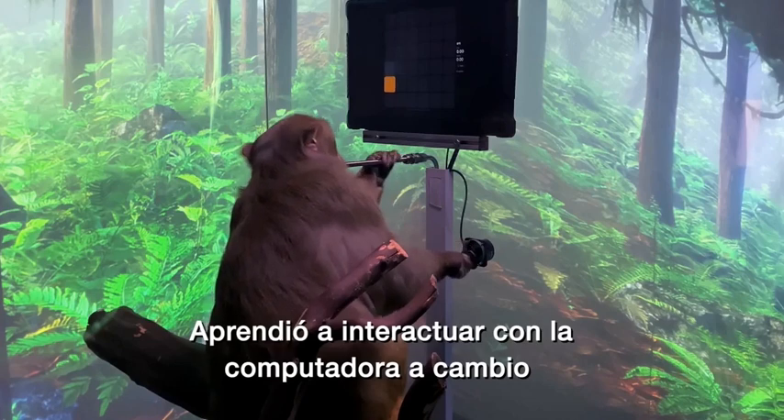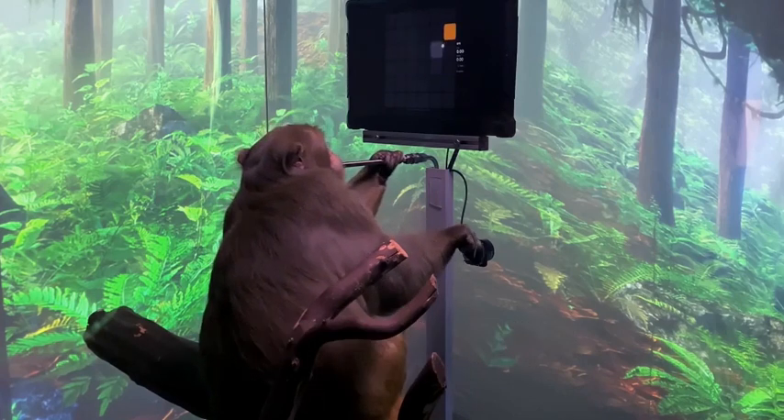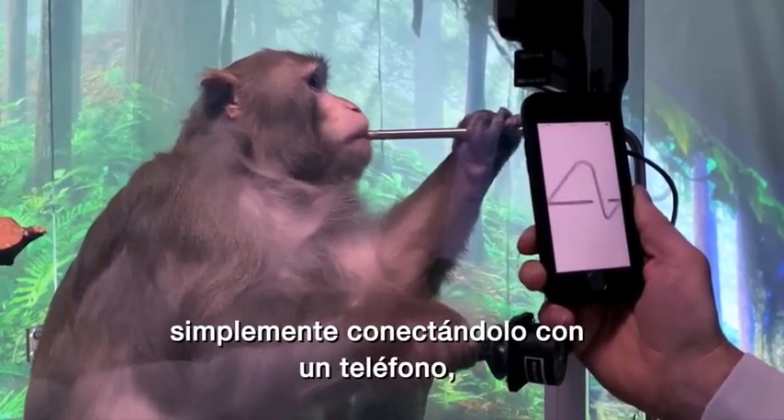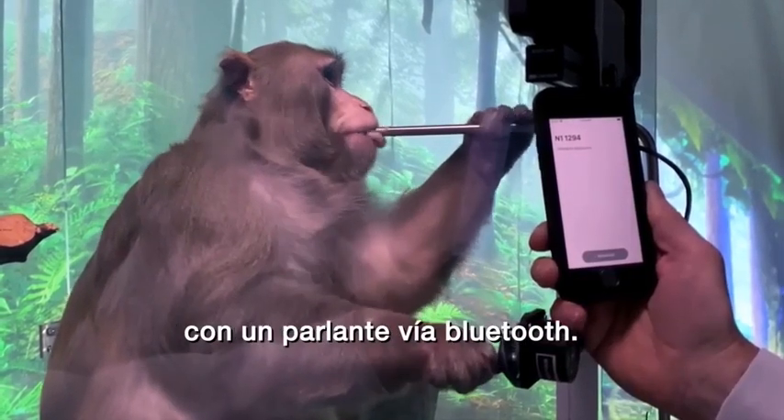He's learnt to interact with a computer for a tasty banana smoothie delivered through a straw. We can interact with the Neuralinks simply by pairing them to an iPhone, just as you might pair your phone to a Bluetooth speaker.